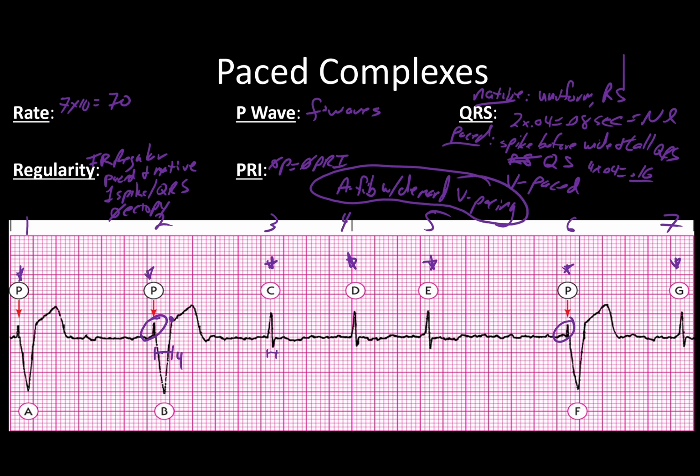And this captures that idea that pacemakers aren't really meant to do everything for the heart. It's not meant to supplant the heart as much as supplement. It should be there as an assistant, not the one to take complete control and do everything all the time. So this is a very, very good example of how modern pacemakers function.